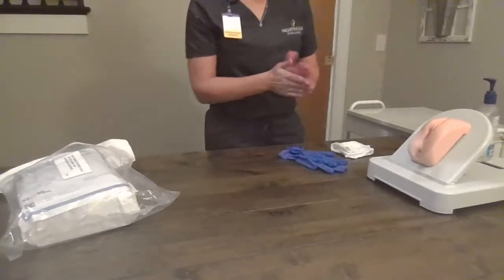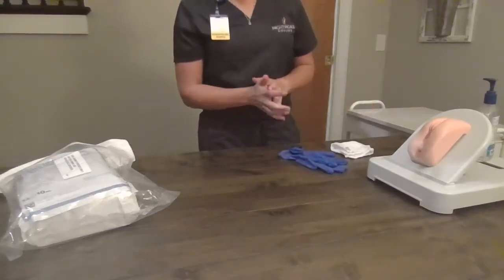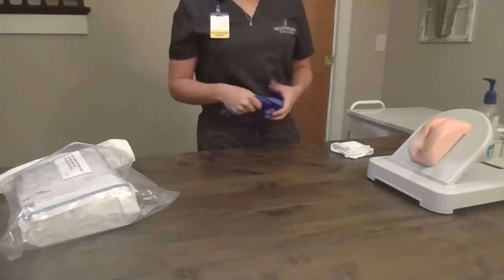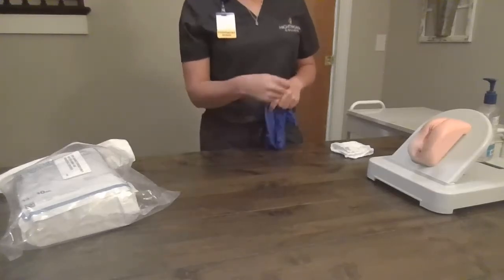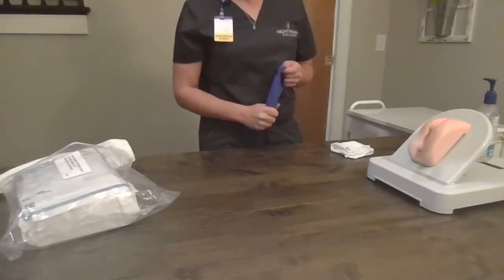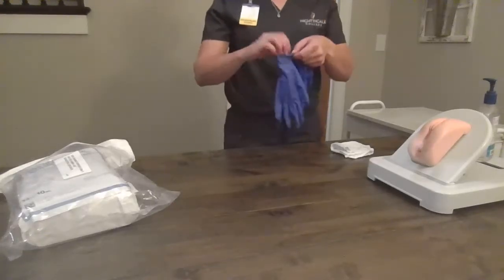Hi ma'am, I'm Kim, I'm going to be your nurse today. Will you verify your name and date of birth? Verify on the wristband with two patient identifiers. Ms. Smith, today the doctor has ordered the placement of a Foley catheter, which is a tube that's going to sit in your bladder and continuously drain urine. Is that okay if we place that today? I will gain my patient's consent.